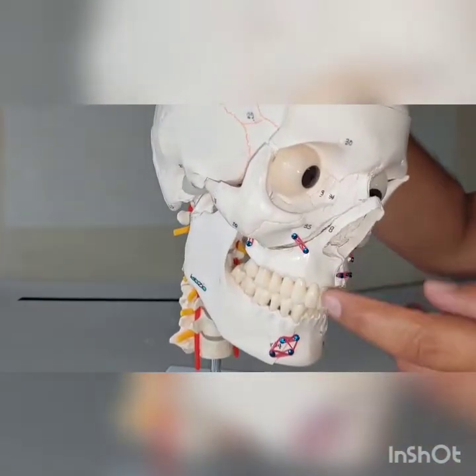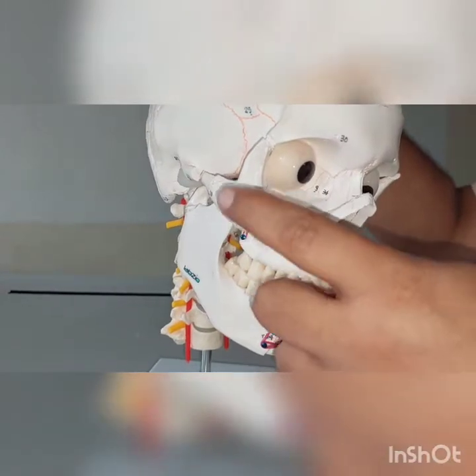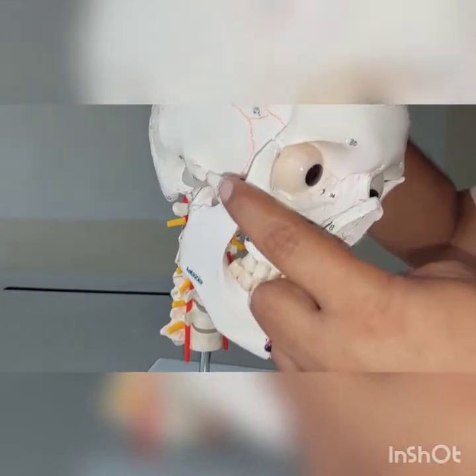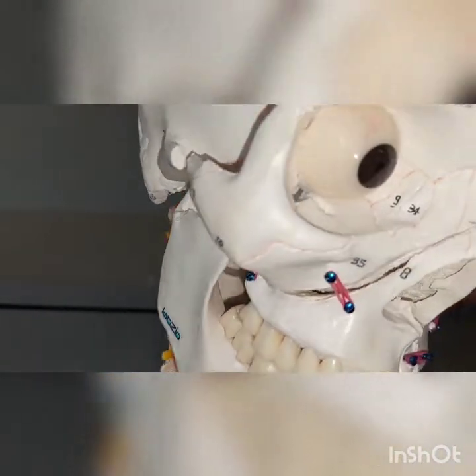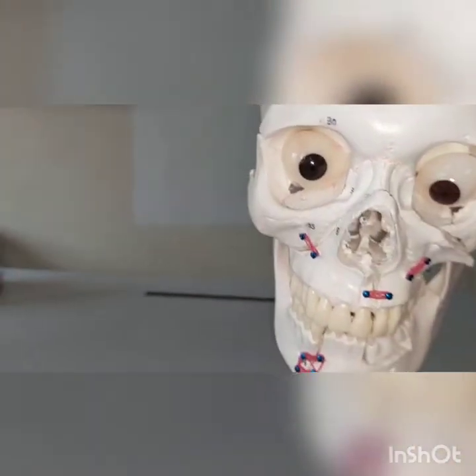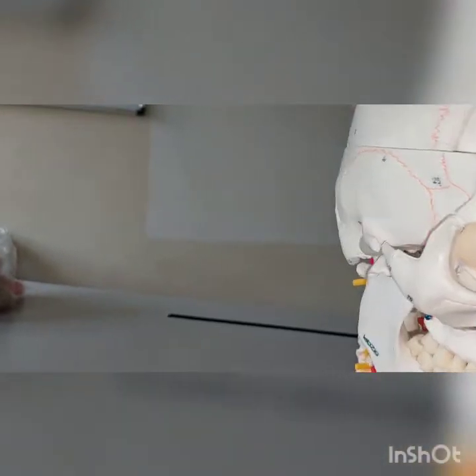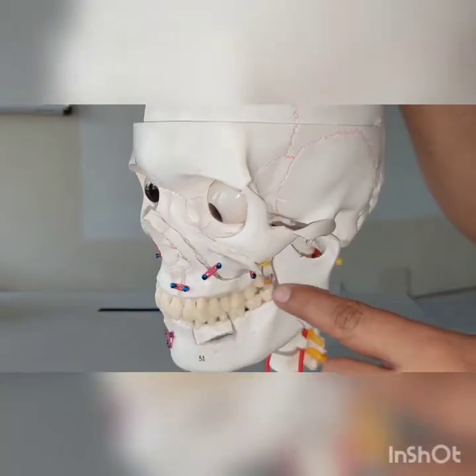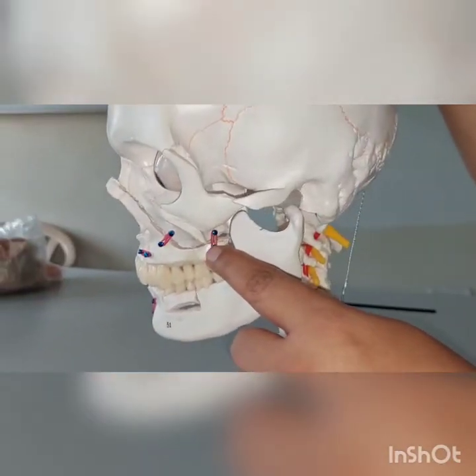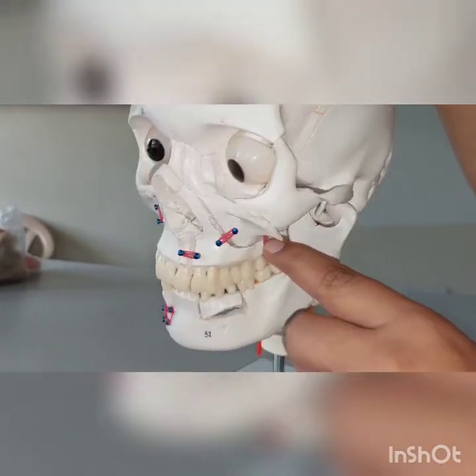Next, coming on to the maxillary fractures, first we will see the Lefort 3 fractures involving the bilateral frontozygomatic regions. Next, the infraorbital regions, this fracture extending on to the pterygoid plates.